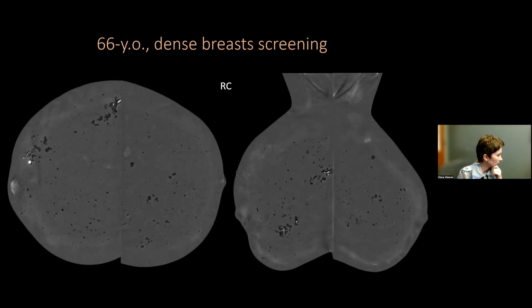And immediately you can see that something is different here. Something that stands out is this enhancing mass at 11 o'clock of the left breast. She does have a mild background parenchymal enhancement, mostly along the edge of the breast, a so-called breast-in-breast artifact, but it's pretty symmetric and easy to dismiss once you get used to it, but this is definitely something that stands out.